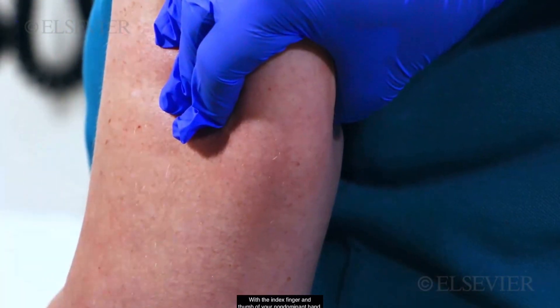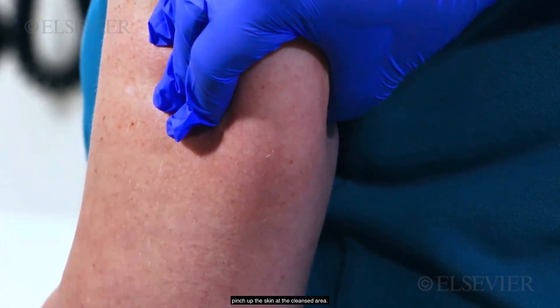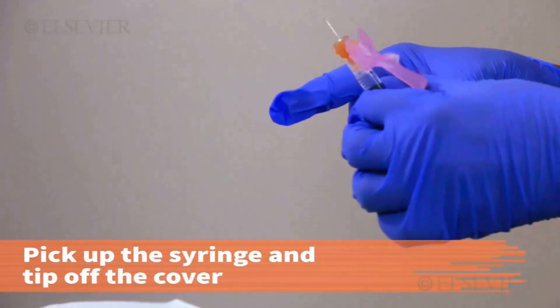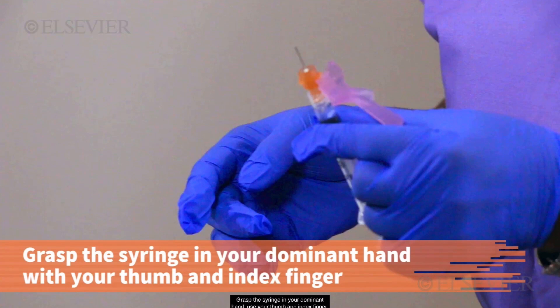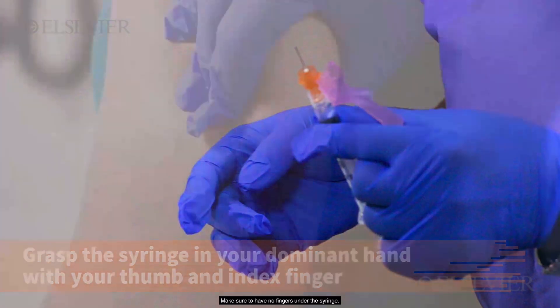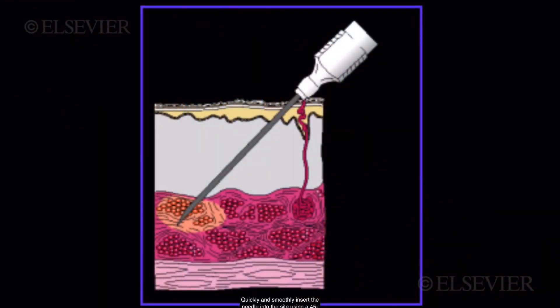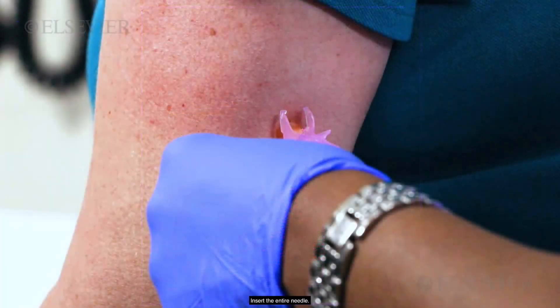With the index finger and thumb of your non-dominant hand, pinch up the skin at the cleansed area. Pick up the syringe and tip it to remove the cover. Grasp the syringe in your dominant hand using your thumb and index finger, making sure to have no fingers under the syringe. Quickly and smoothly insert the needle into the site using a 45 or 90 degree angle, depending on the needle size. Insert the entire needle.